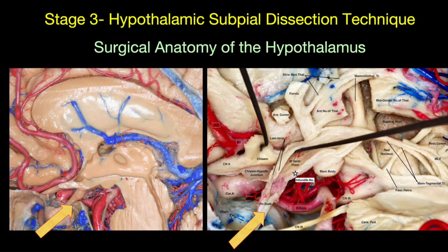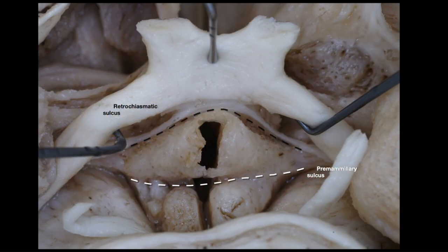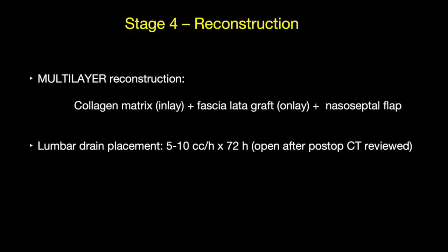The next stage is the key hypothalamic sub-pial dissection technique, which allows us to preserve the hypothalamus and dissect the tumor at the hypothalamic attachment. Finally, the multilayer reconstruction uses collagen, fascia lata, nasoseptal flap, and the key addition of a lumbar drain placement for three days to prevent CSF leakage.